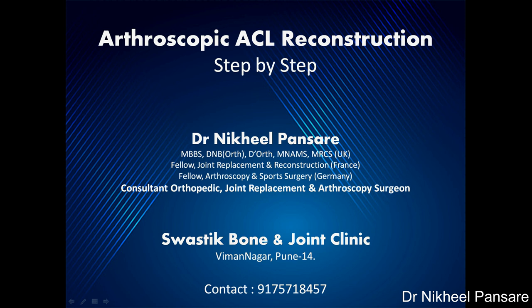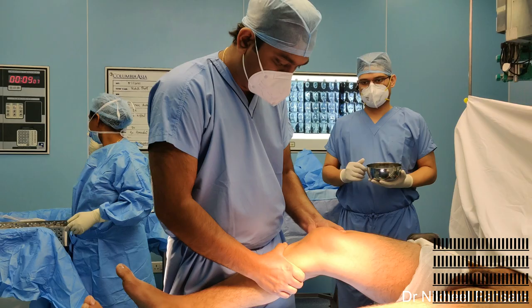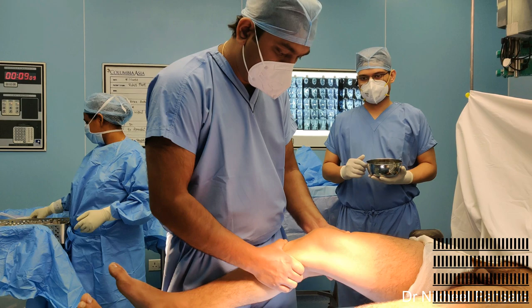Hello everyone, I am Dr. Nikhil Pansare. Today we will see arthroscopic ACL reconstruction surgery step by step, which I feel are very beneficial for beginners. These are key MRI images showing ACL discontinuity on sagittal cut and empty lateral wall on orthogonal view. Evaluation under anaesthesia reveals grade 3 Lachman and a positive pivot shift test.